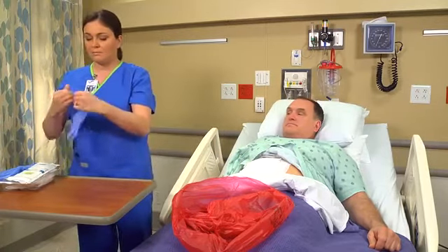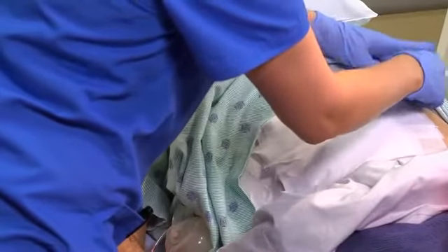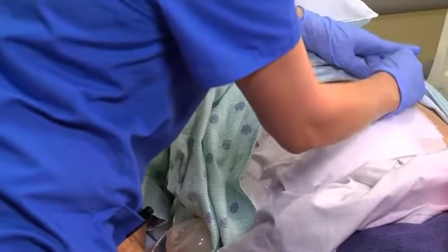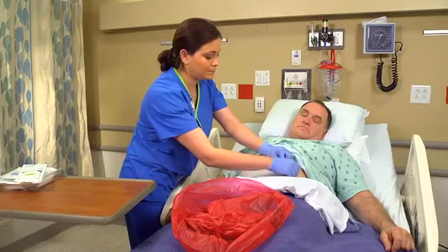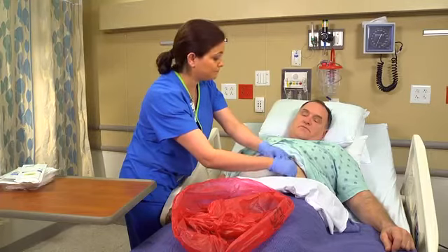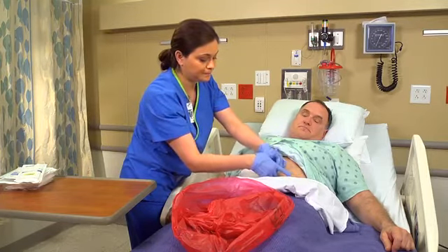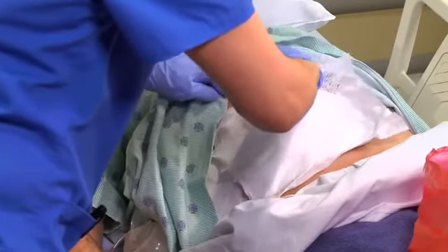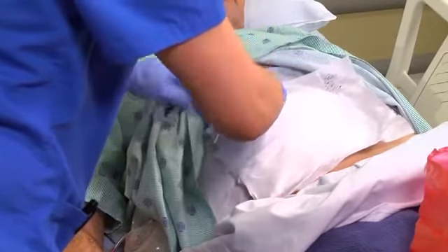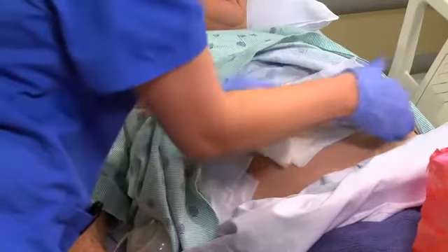Apply clean gloves. Now you're ready to take off the old dressing. Remove the tape by pulling it parallel to the skin toward the dressing, holding down the uninjured skin. Be sure to pull in the direction of any hair growth. If necessary, obtain the patient's permission to clip or shave the area according to your agency's policy. Remove the old dressing one layer at a time with your clean gloved hand or with forceps. Observe the appearance of the drainage as you proceed.